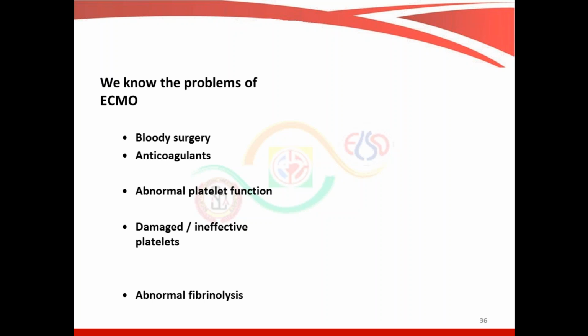So whatever your institution protocol is, I go and tell everyone, do not buy an ECMO machine without buying a point of care and an echo machine. Your patient will do very, very well. The Pediatrics Department of PGI Chandigarh has just done that, and they are reveling in it.